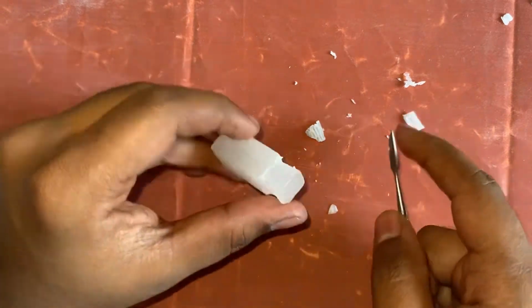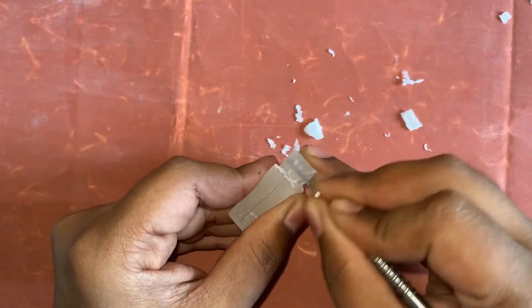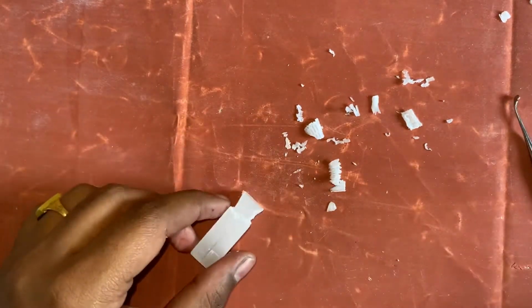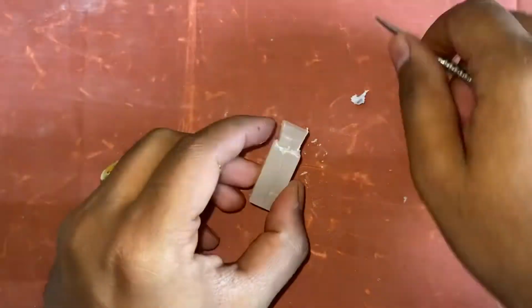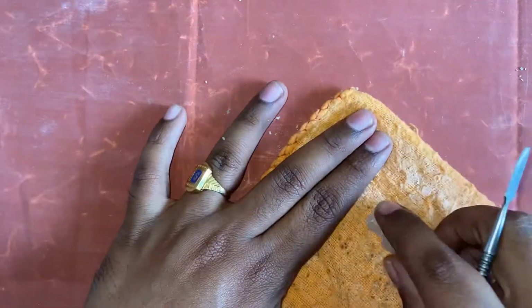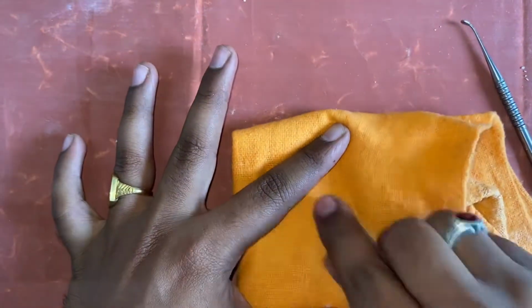Remove the wax from the labial side and also from the lingual side. Scrape the wax to give the crown a wedge shape appearance. After every step of scraping out the wax, you have to polish it with the help of a polishing cloth so that you can again carve it gently and the wax does not stick onto the block.